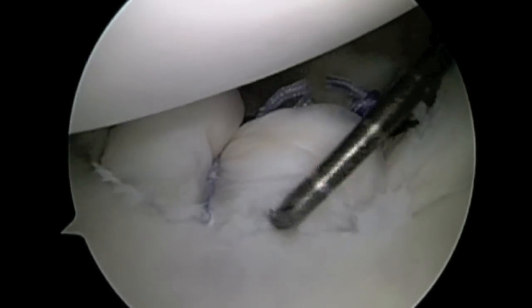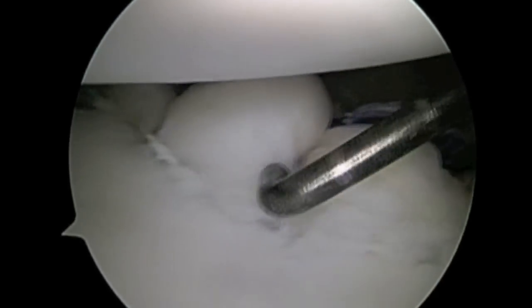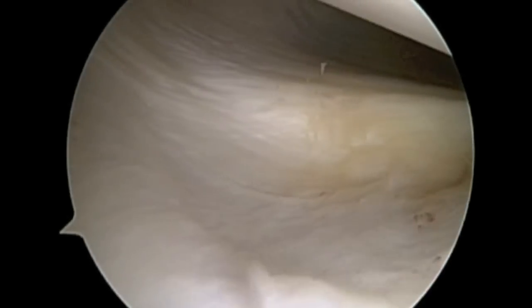The final repair is then assessed for stability and this is found to be excellent. The labrum has been repaired against the glenoid and the capsule has also been tightened, as is seen here.